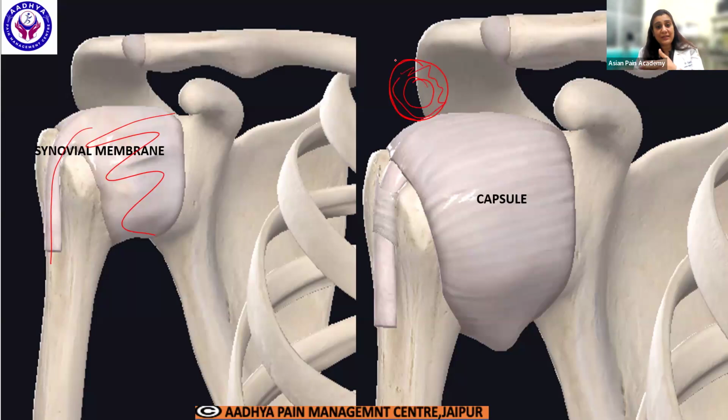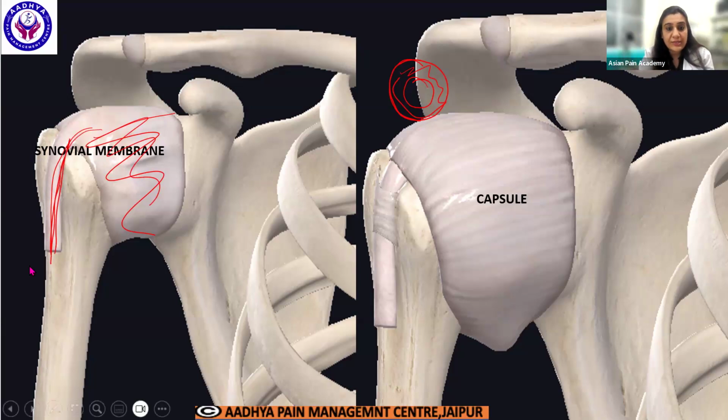Some tendons do not have the sheath; they have loose areolar connective tissue around them, which just gives nourishment to the tendon. This you see in the Achilles tendon. All these basics of ultrasound are very important because they are the foundation for us. So this synovial membrane has a distal projection, and this forms the sheath.